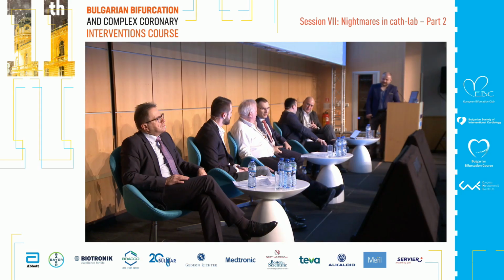This is my personal advice about that. This is my comment, because everything in the case afterwards comes from the decision to stent this stenosis. If you escape this moment, you will save a lot of adrenaline for you and for the patient.